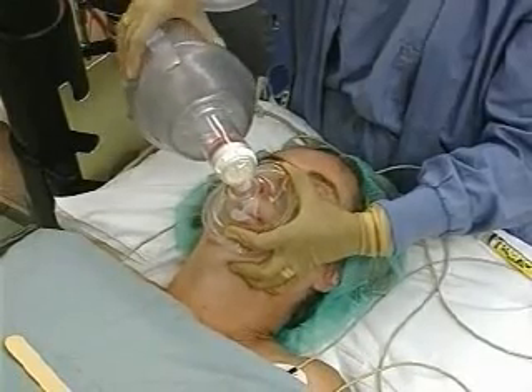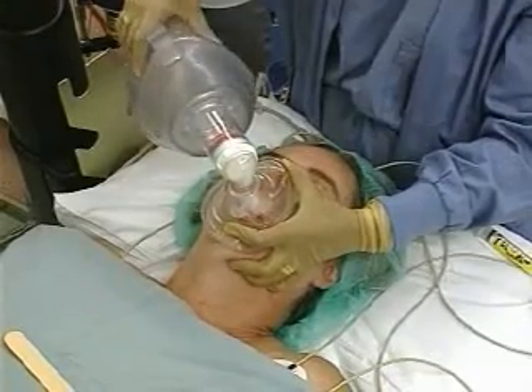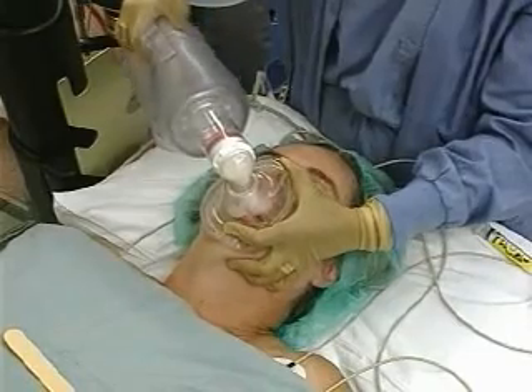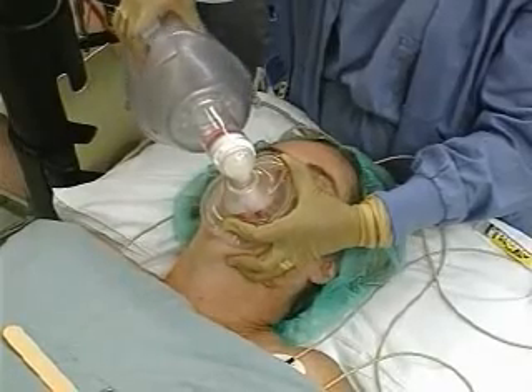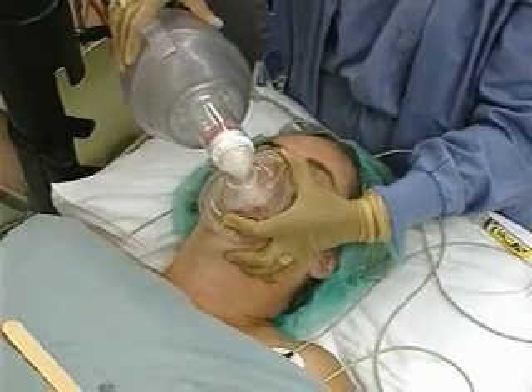Deliver intermittent breaths with the right hand on the ambu bag. In a spontaneously breathing patient, time the delivered breaths to coincide with the patient's inhalations. In the tachypneic patient, alternate the assisted breaths with spontaneous respirations. Buccal gauze sponges can be placed in the cheeks of an edentulous patient to improve fit to the face.